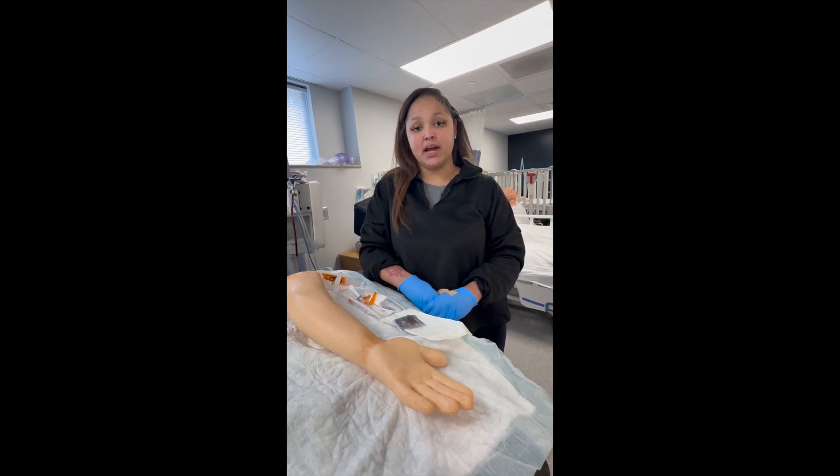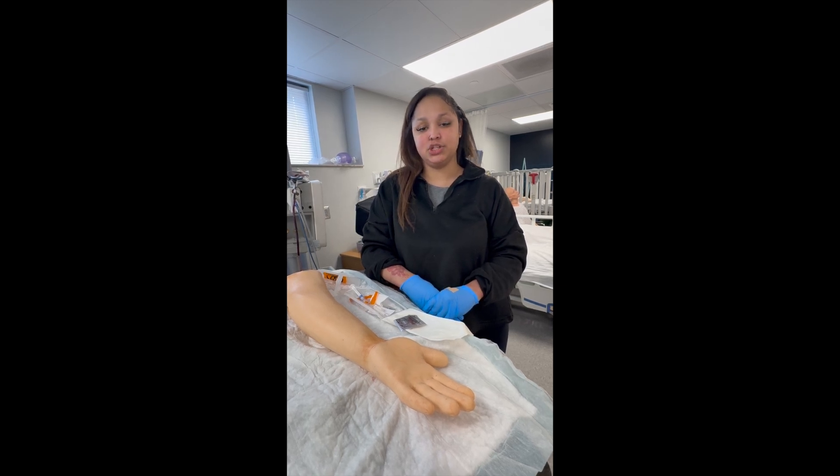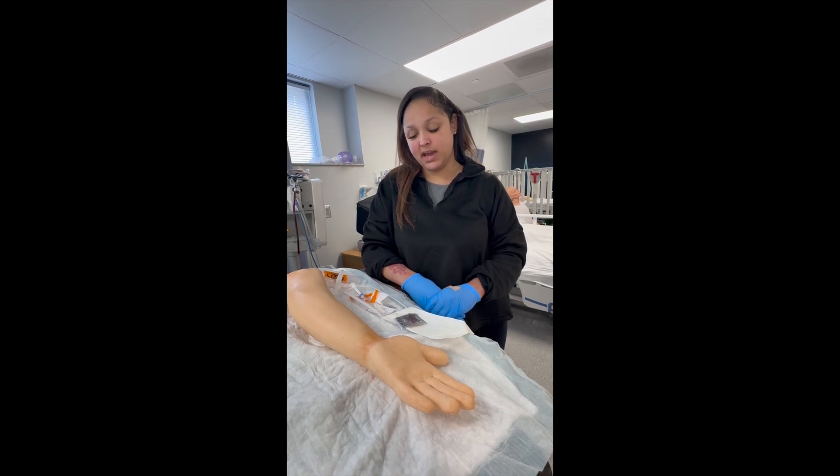Prior to drawing your blood gas, you should check in the chart to make sure there is an order, because this is an invasive procedure. Second, you should perform an Allen's test on the extremity that you're going to be pulling the gas from, to check for collateral circulation.